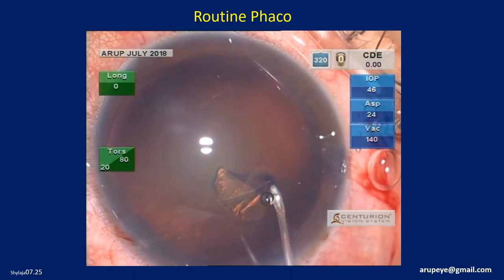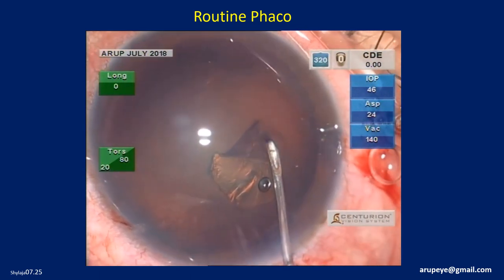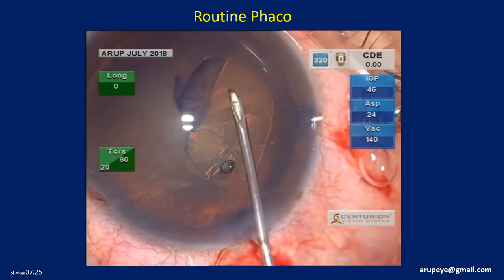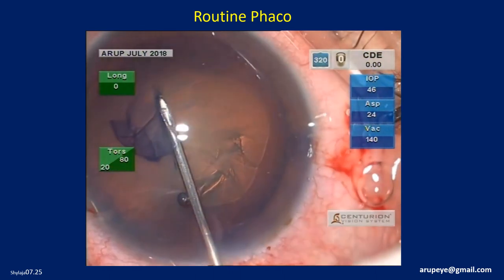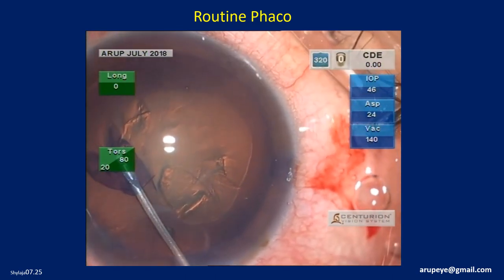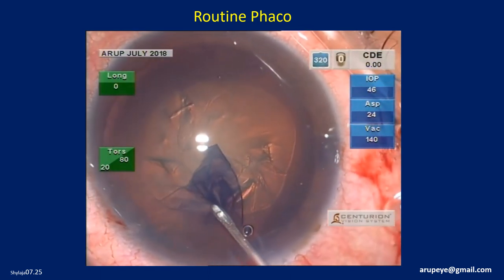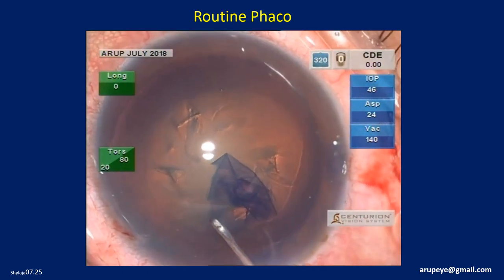Capsular rhexis is initiated and continued with a bent 26-gauge needle. We plan to create a 5 mm rhexis. The size of the rhexis is controlled while initiating it, and the diameter can be adjusted intraoperatively during the subsequent capsular tearing process. Because of the Helon GV, a significant drag is required to tear the anterior capsular flap. One could also use a rhexis forceps instead.